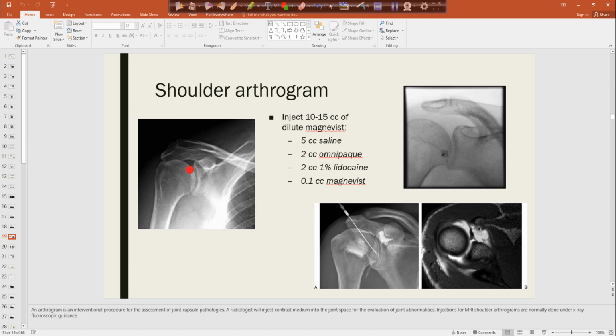All right, your arthrograms. So in the past, when you were on the X-ray side, usually your MR techs brought the patient down, and they had that bag with the syringe, and then usually they had the vials along with it. Is that how they handled most of your arthrogram patients? How did they present your arthrogram patients in X-ray?